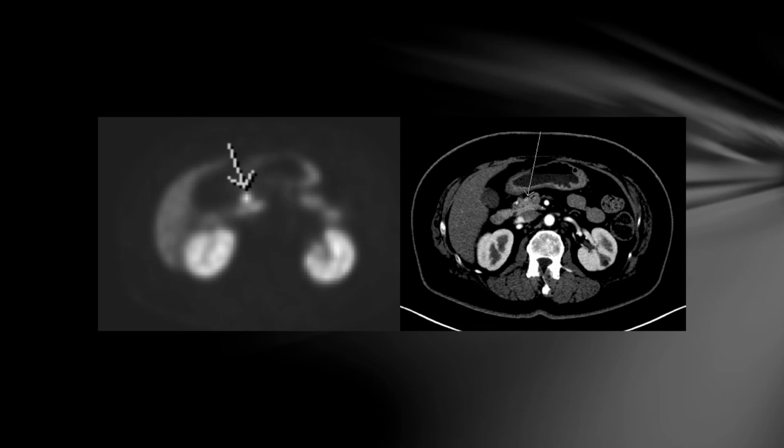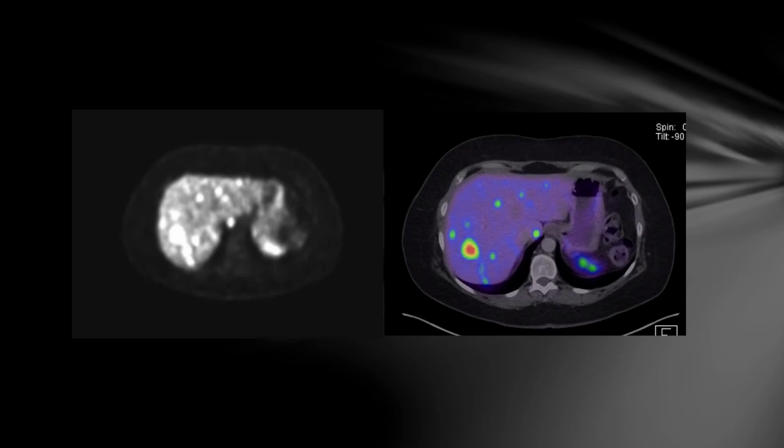Another real strength of functional imaging over conventional imaging in neuroendocrine tumours is in bone disease, which is often what we call CT occult, cannot be seen on CT. So this patient demonstrates uptake there within the right iliac bone, which is highly suspicious for metastasis, but a CT performed at the same time demonstrates no abnormality.